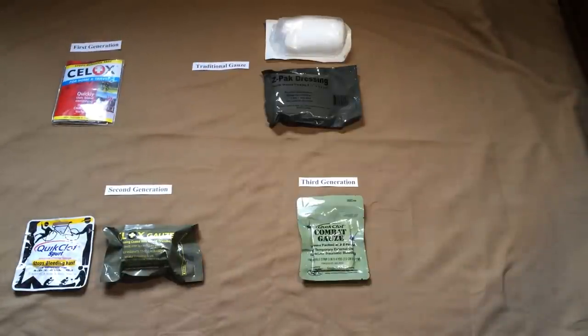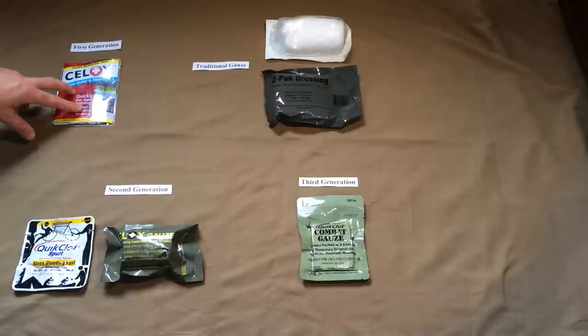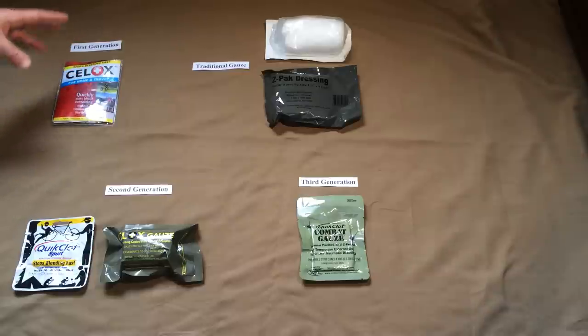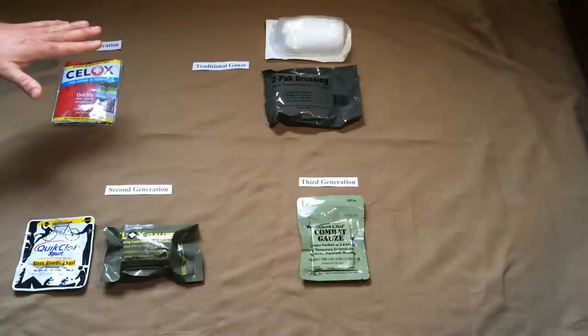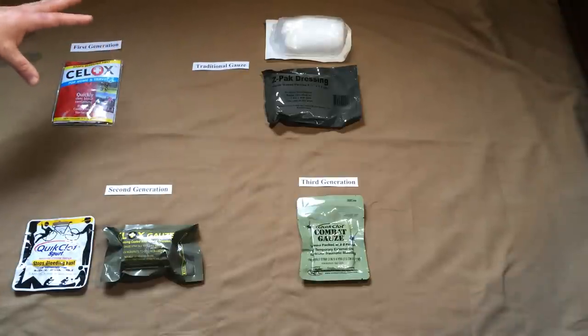Going over the evolution of these dressings, there are basically three generations. To begin with, we had the first generation — I have only one example, which is the Celox brand. What you had in the first generation were granules that were basically sprinkled into the wound bed itself, then compressed with an additional secondary bandage held in place, and allowed to do what they needed to do to control the bleeding.